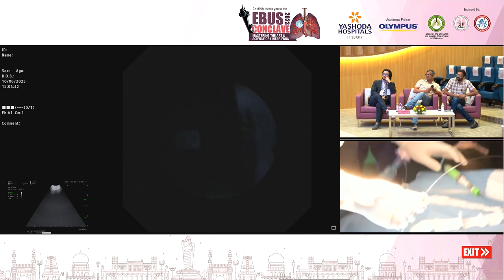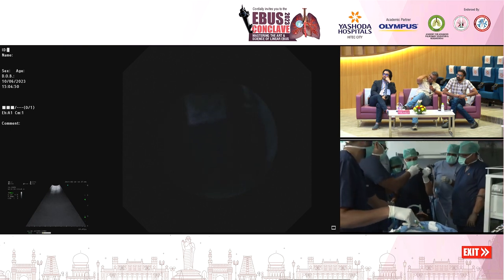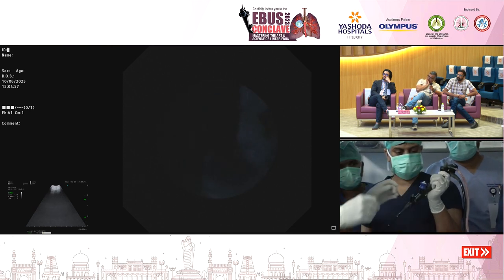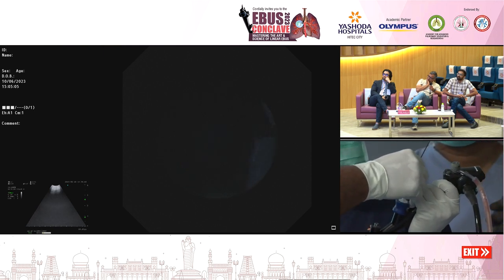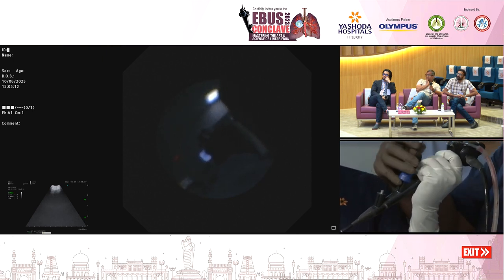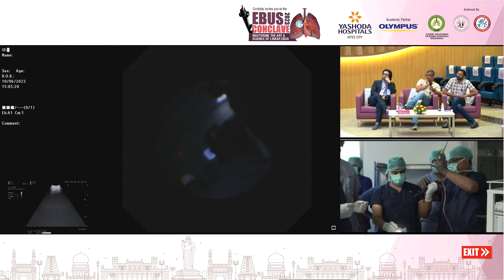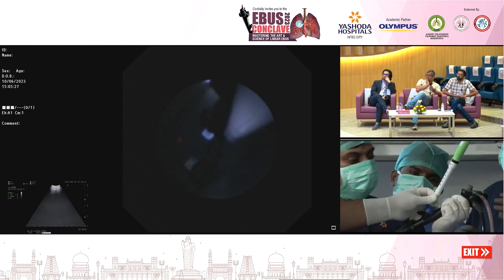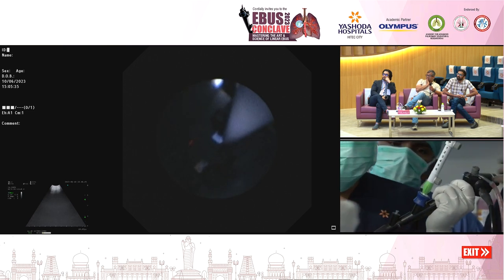Okay. Adapter. So the adapter has been placed and now we'll be passing the needle through the channel. Every needle has its own mechanism of fixing. The Boston needles generally have a screw like mechanism which we will just screw on, tighten and lock it. A sheath needs to be fixed for this needle too before every procedure. So we will just fix the sheath.